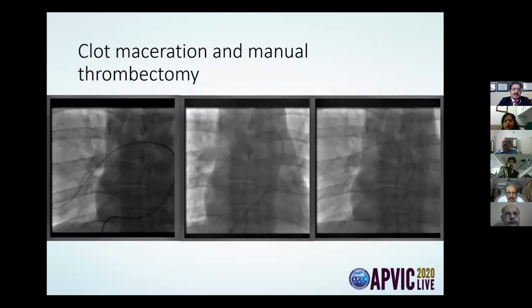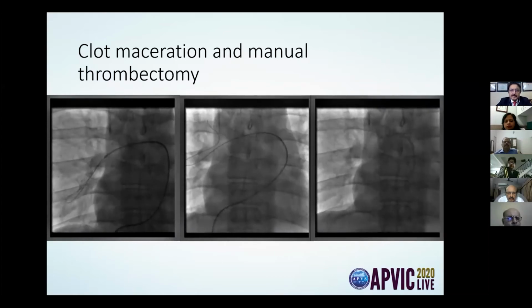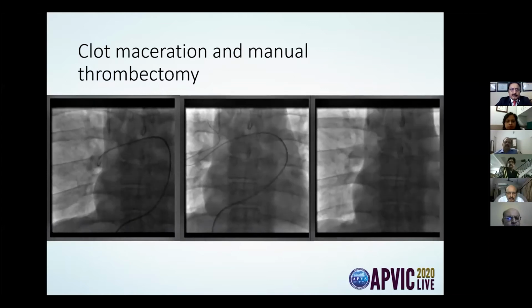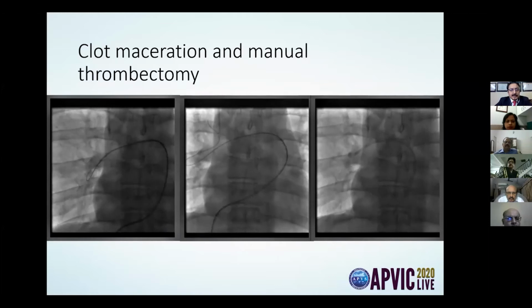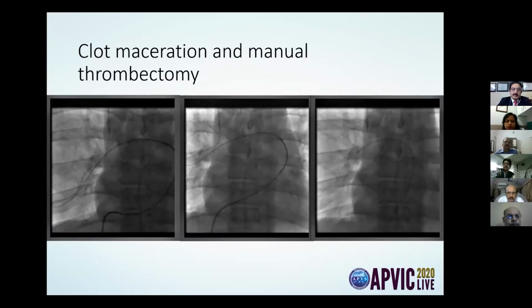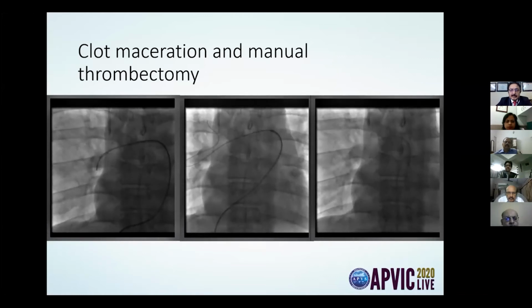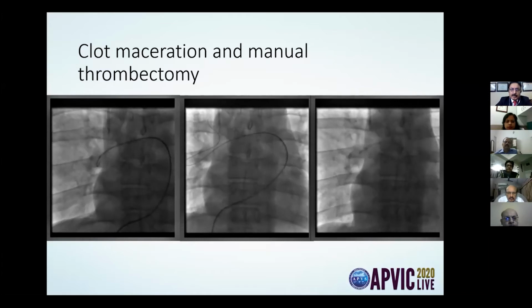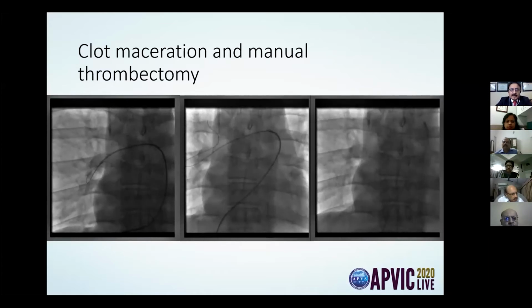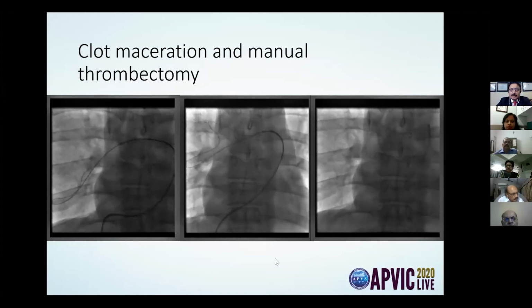And if you see here, we had only two options. The patient is coding on heavy inotropes, the patient is hypoxemic and hypotensive. We had to establish antegrade flow. The first thing we did was take a small wire and macerate the clot so that we can establish antegrade flow. This is what we always do, and we have developed the strongest pulmonary thrombectomy and catheter-directed thrombolytic therapy program in the whole of North India. And after we do this, we go to each segmental pulmonary artery. And the second, we go ahead.